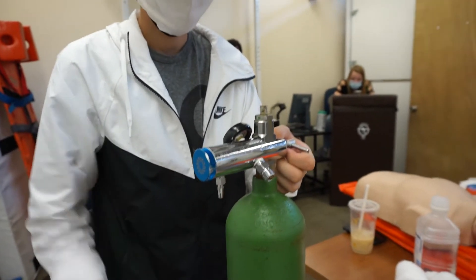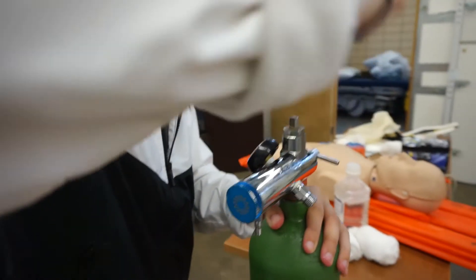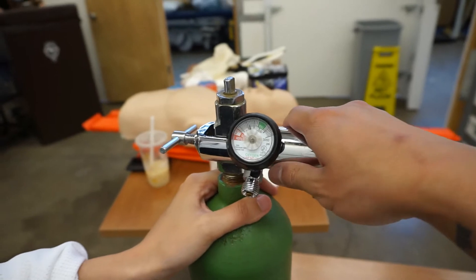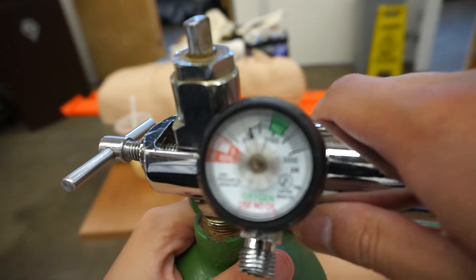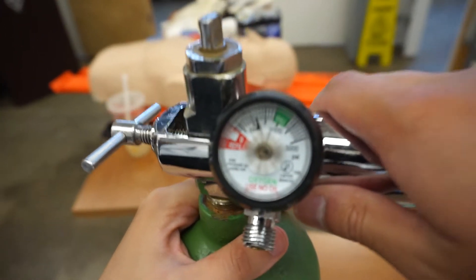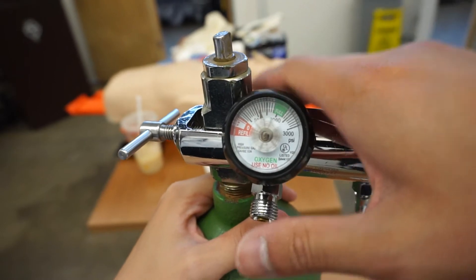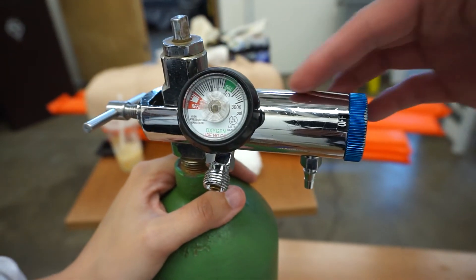And then go ahead and crack the tank. Great. And so now when we look at the regulator, we should see the regulator's at a certain pressure. So right now it's about 1100, and now we have a fully pressurized regulator.